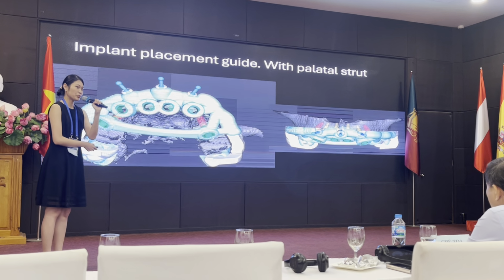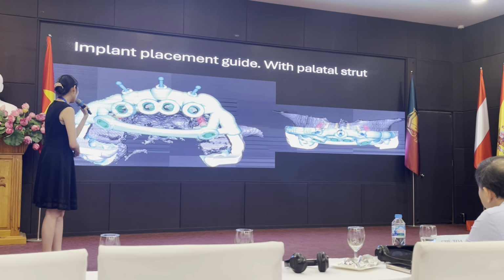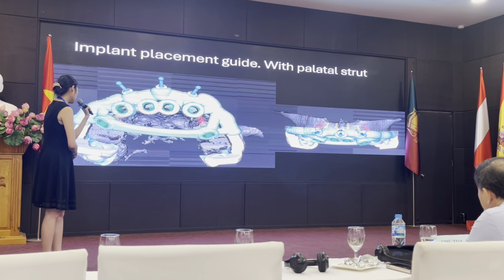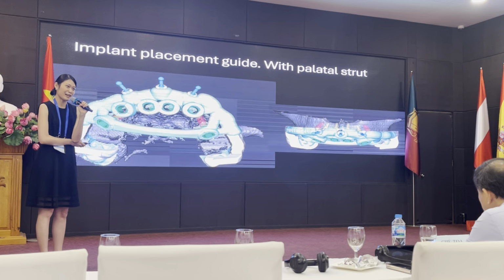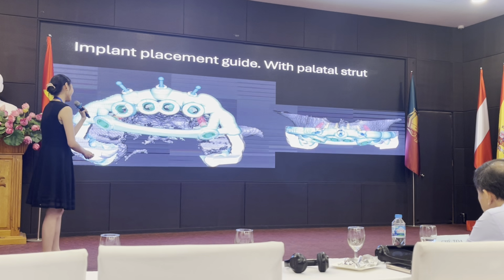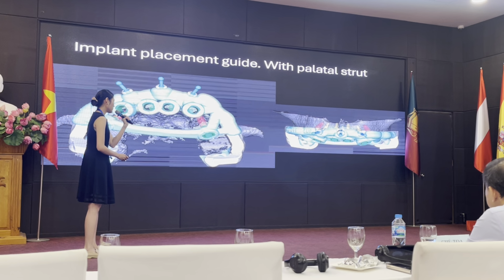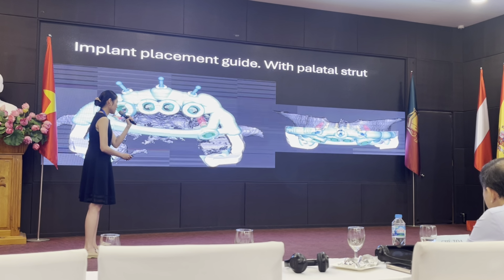And then we went on to design the implant surgical guide. So here we have in total 6 dental implants, and ideally it should be on the palatal side. So one thing I've been thinking about: would you say a hybrid prosthesis is surgically driven or implant or prosthetically driven? I think that's the thing we have to think about. And this would be the implant position. So as you can see, this is a stackable surgical guide that will rest on the guide that we previously set.